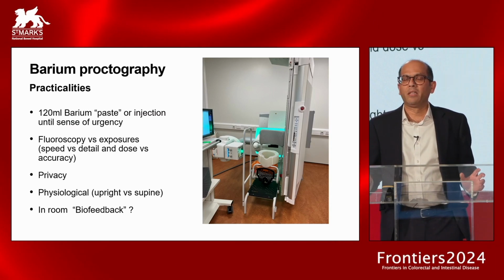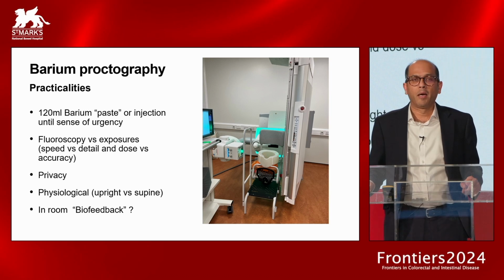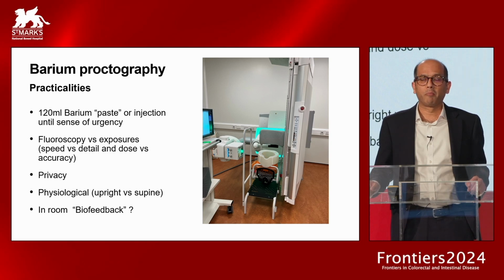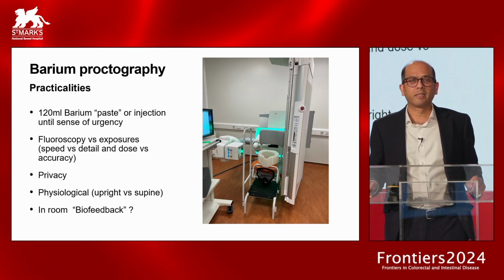Although I know in the literature now, over the last approximately 10 years, most of the literature, certainly within the radiology publications, focuses on the use of MR proctography, but actually there's still quite an important role, and I'm going to try and set out what are the relative advantages and disadvantages between these two techniques. So I've shown a picture just to give those people who haven't actually seen the setup some of the realities, and also just run through the technique.